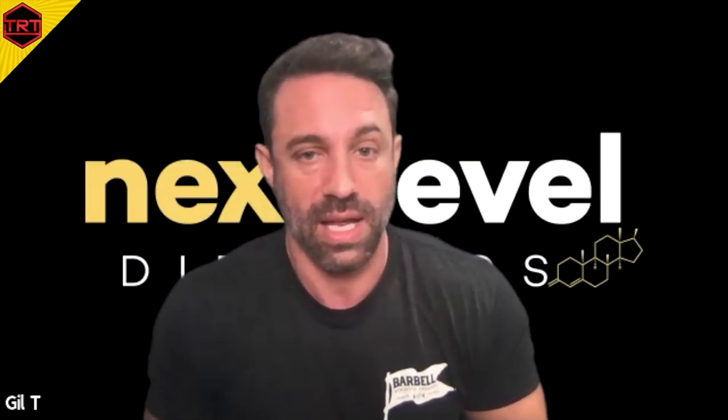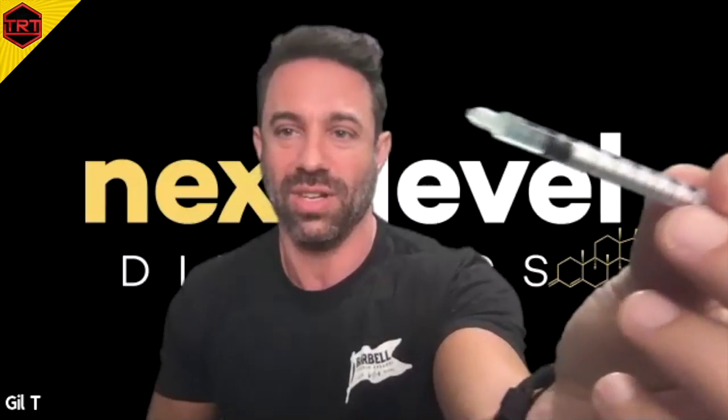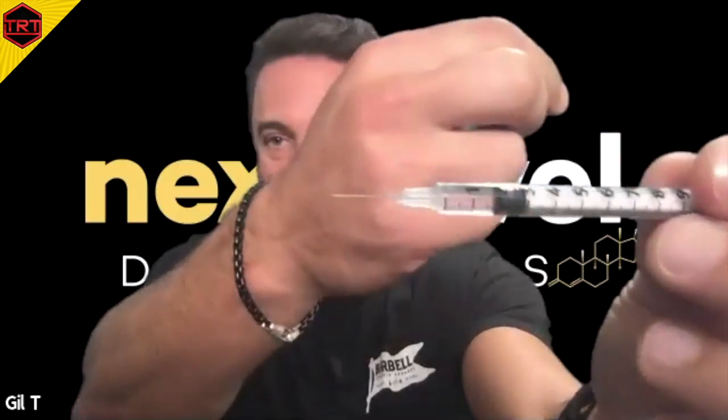It does feel kind of bony when you press on it, and people ask if they're hitting their hip bone — the answer is no. I've used up to an inch and a half and you're still good. If you're using insulin syringes, like the 50 or 100 unit, 29 or 28 gauge insulin needles — I put very little in here as it's not exactly my dosing day, so I did 40 milligrams of testosterone just for demonstration. We've got a half-inch needle, so it's going to be very shallow.